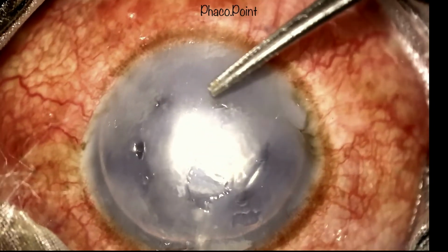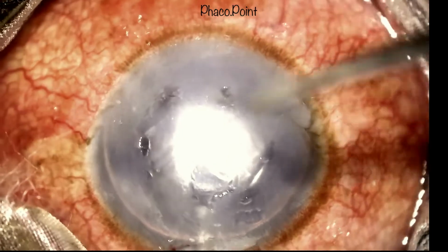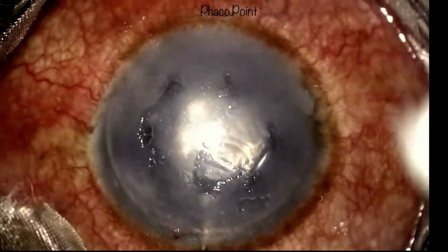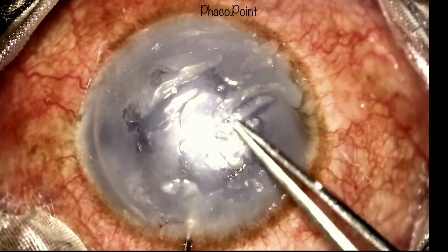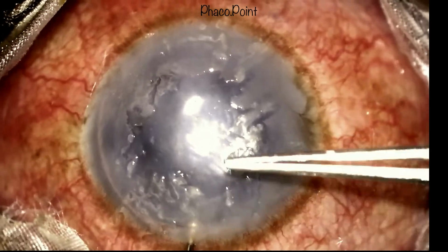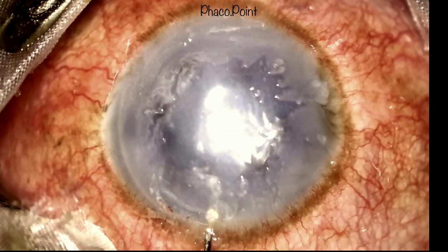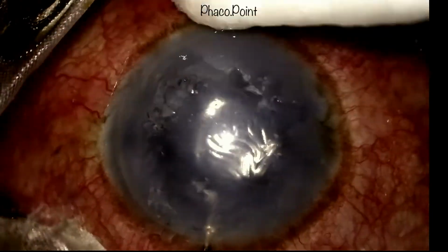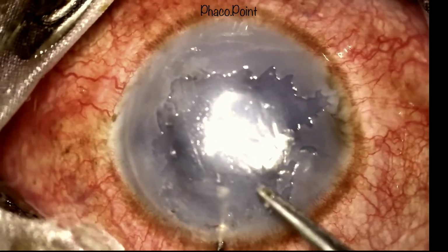Note how slowly but surely the cornea starts to clear as the Descemet starts to get reattached. The corneal epithelium may be debrided with a view of enhancing visibility. Without the presence of an intraoperative ASOCT, it might be difficult to ascertain whether the Descemet's membrane is truly attached or not. Now, how do we ascertain that the Descemet's is attached?